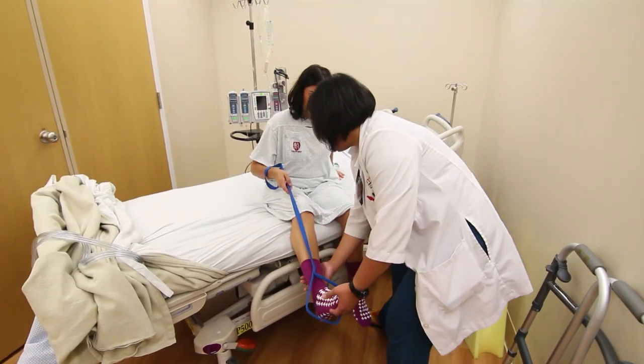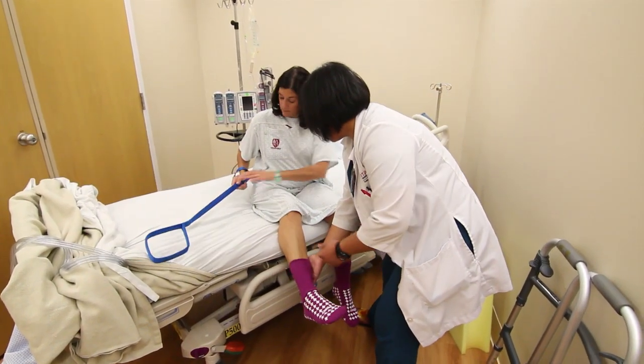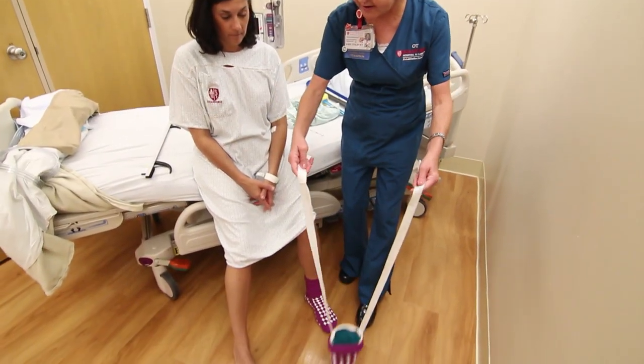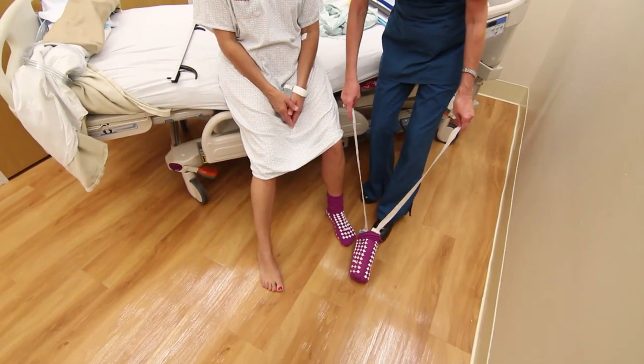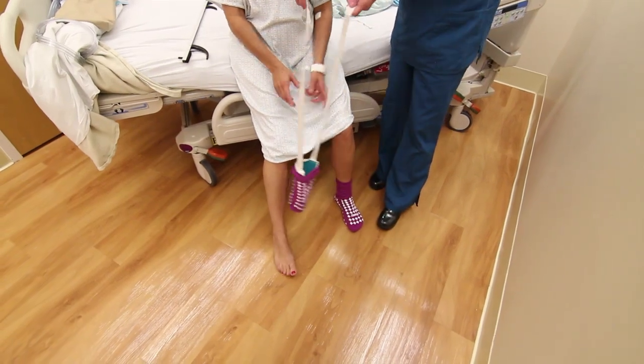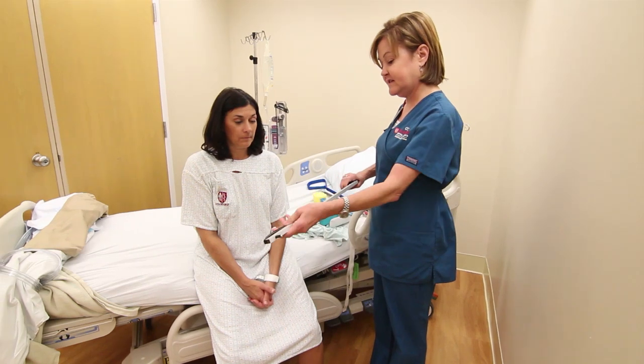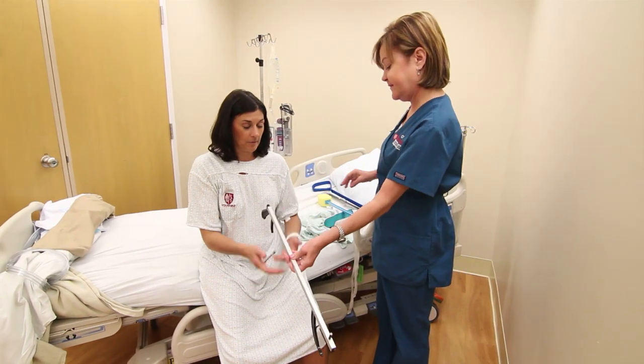There is other equipment often not covered by insurance that is very handy for use after surgery. Examples are a sock aid to help in putting on a pair of socks by yourself, a reacher grabber dressing stick that can help to pull up your pants, reach for dropped items, or obtain items higher than your arms can reach, and a long-handled sponge that can help you clean hard-to-reach places during bathing.